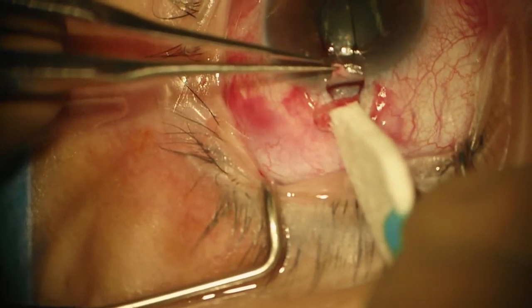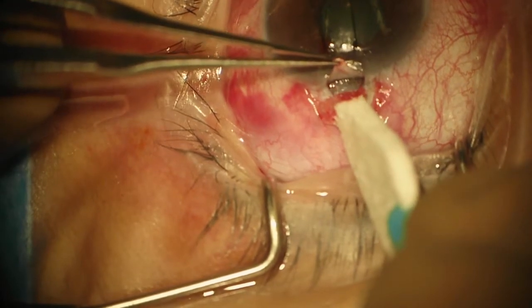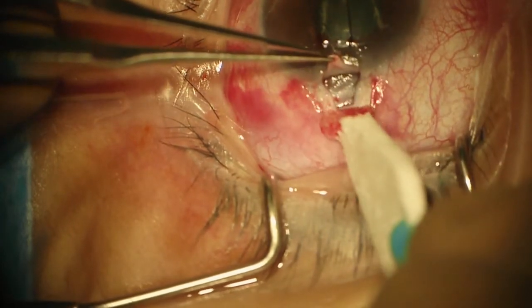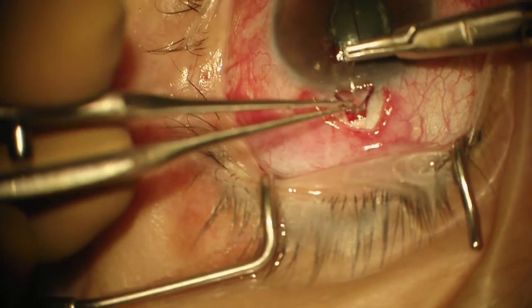You can see the transition to the blue zone right anterior to where my Weck-cel is, and as long as we stay working in that zone we should have a nice anterior trabeculectomy. I'm going to replace my apical suture.